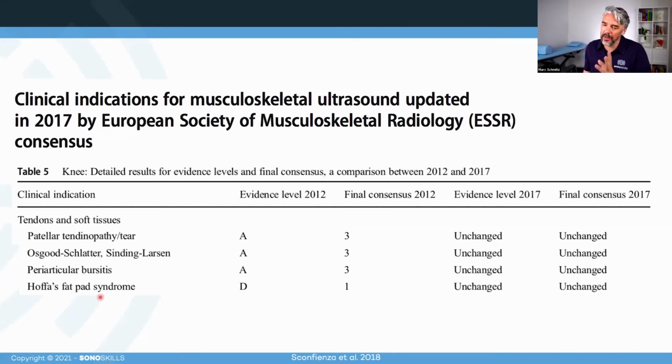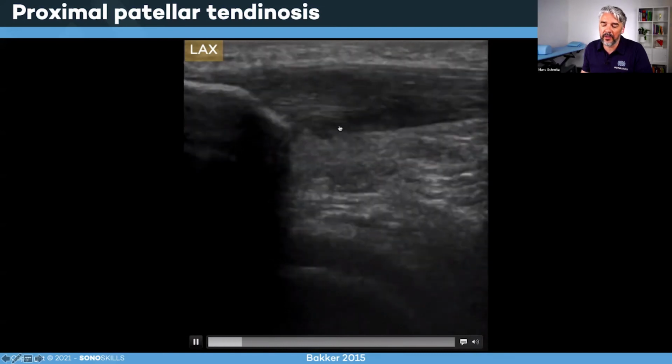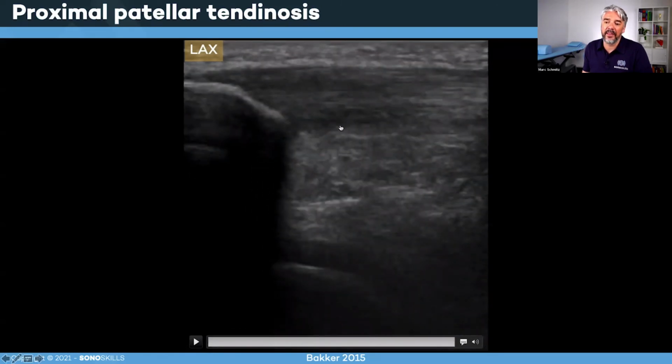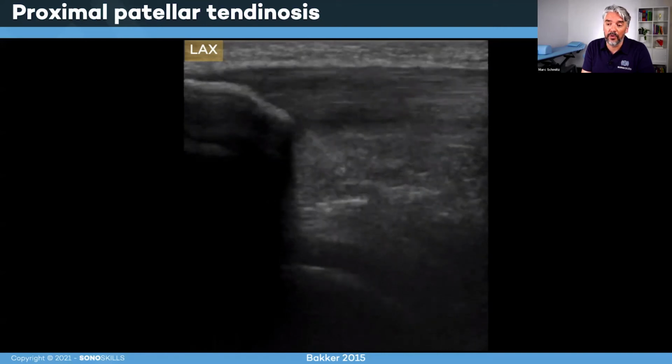For Hoffa's fat pad, it is a little bit more tricky and difficult. This scores a 1, so it's not the preferred imaging tool. So let's look at this patellar tendinosis. This is quite thickened, but if I move from medial to lateral, you can see a dark zone, a dark swelling there. And this is a sign of a jumper's knee, not a severe jumper's knee, but a subtle jumper's knee. And you can see that indeed it's in the depth of the tendon, the weakest spot.